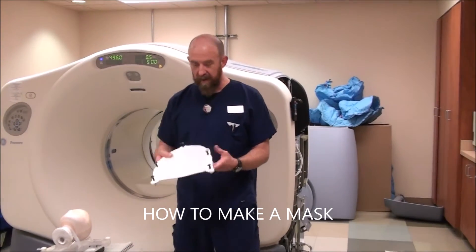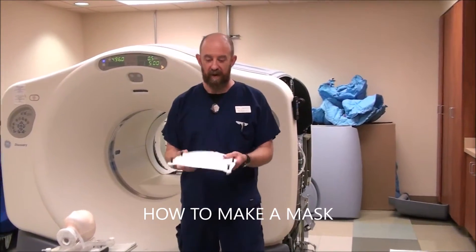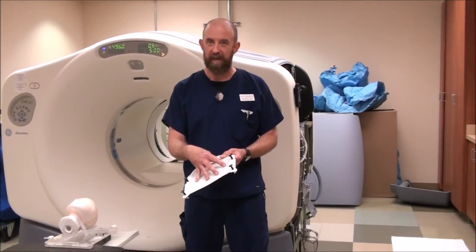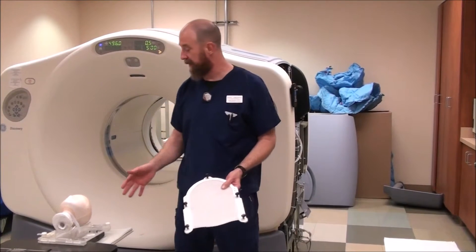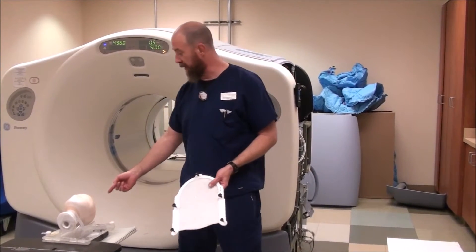How to make a mask. I'm going to show you on a dry mask that has not been heated up, just to walk through because you have to move fairly quickly whenever you're actually making a mask on a real patient or a head.